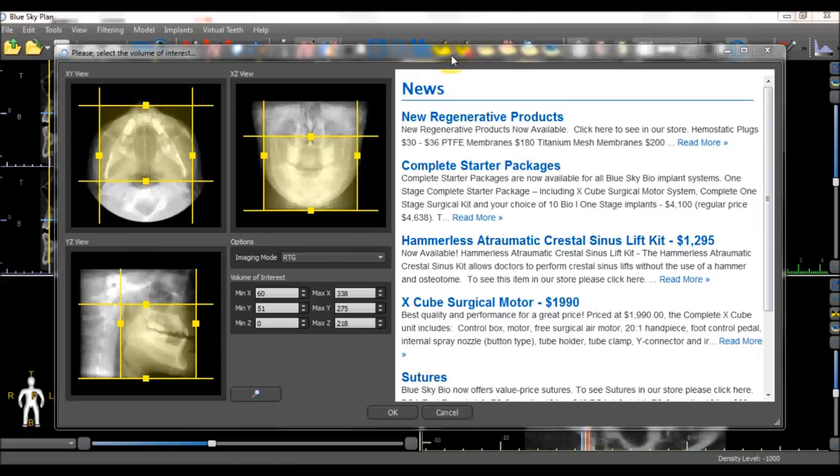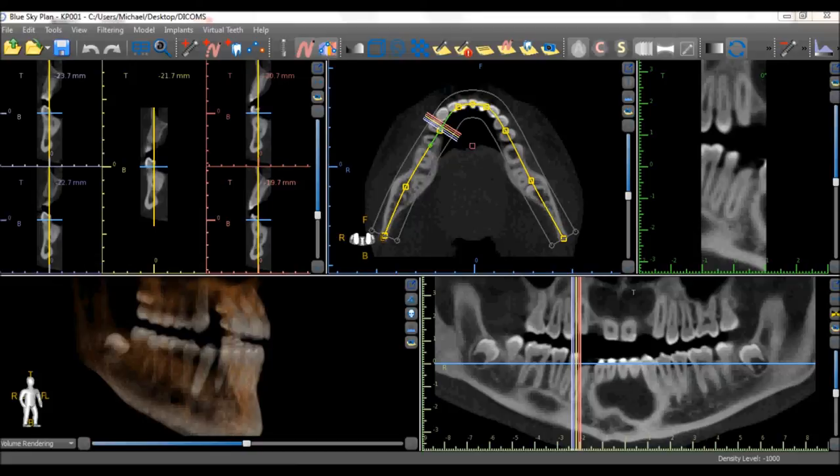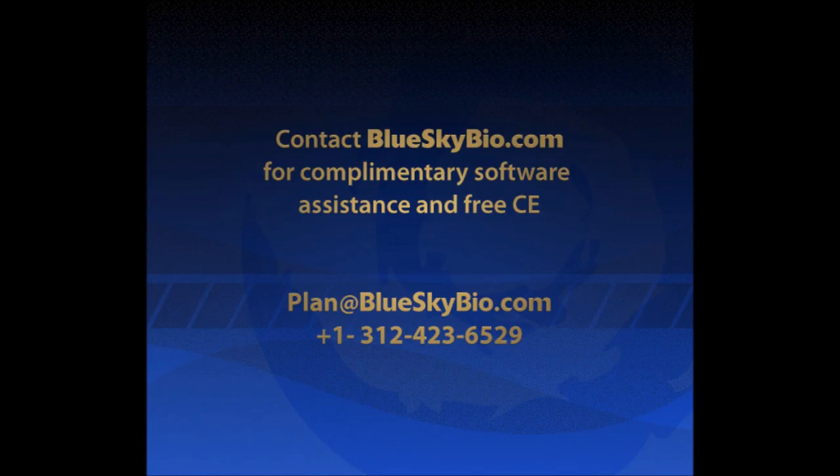Once this is done, we can press the OK button to load the DICOMs into the software.